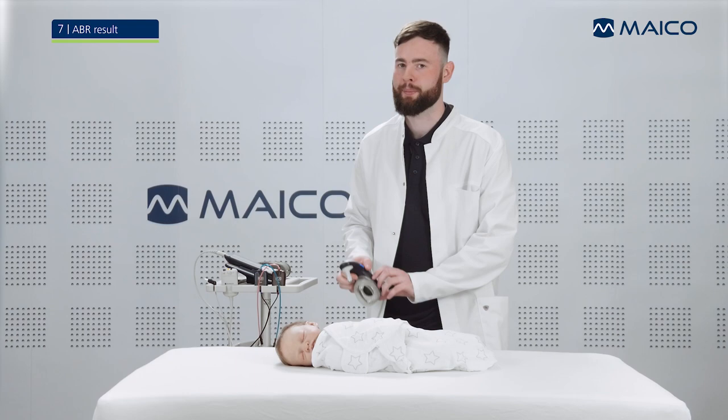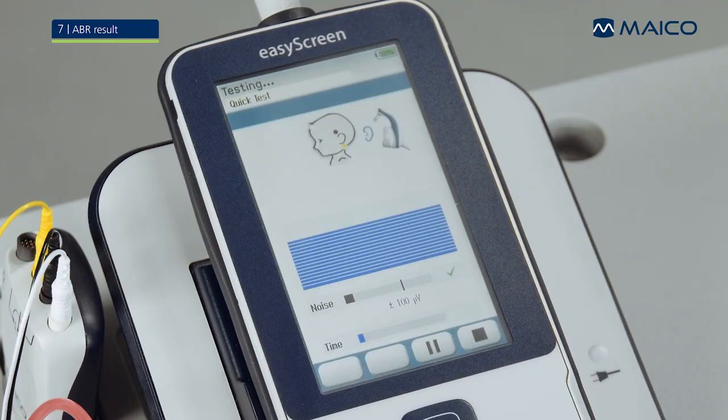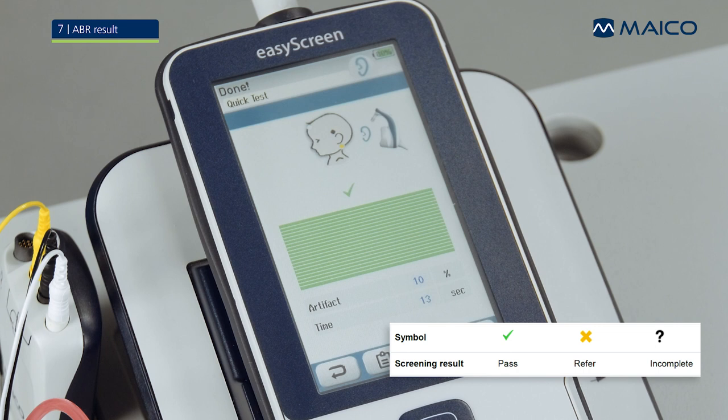Remove the Baraphone from the baby. The result of the screening will be displayed on the EasyScreen. If the baby passes the test, the EasyScreen will show a green check mark. If the baby does not pass the test in a specified amount of time, the EasyScreen will show an orange cross.